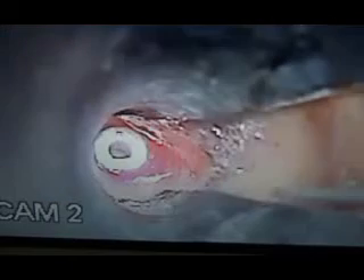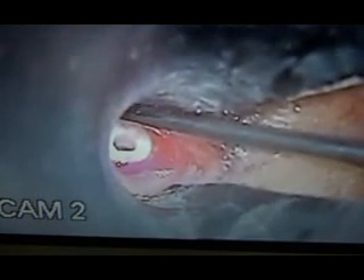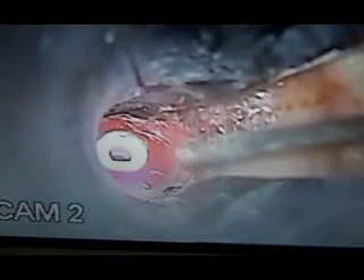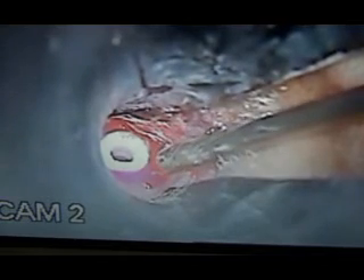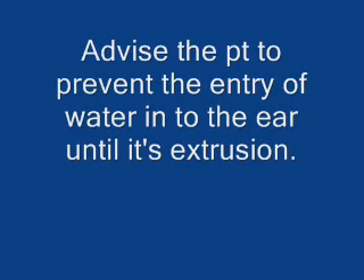Now the grommet is taken with an alligator forcep and just engaged — it will be nicely fitting, as you can see. And this is what it looks like.